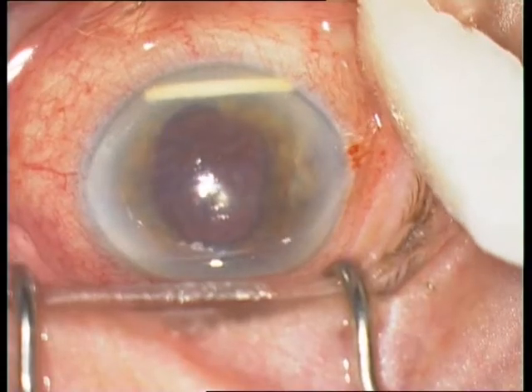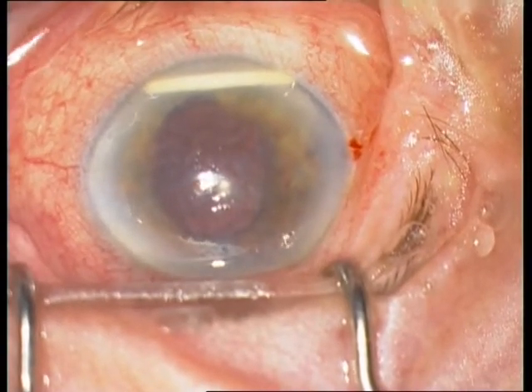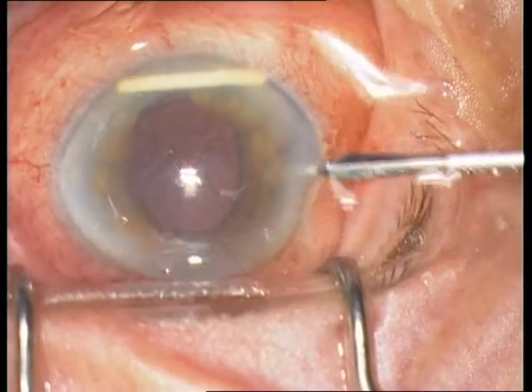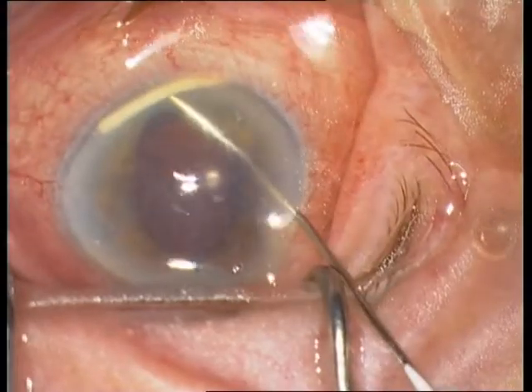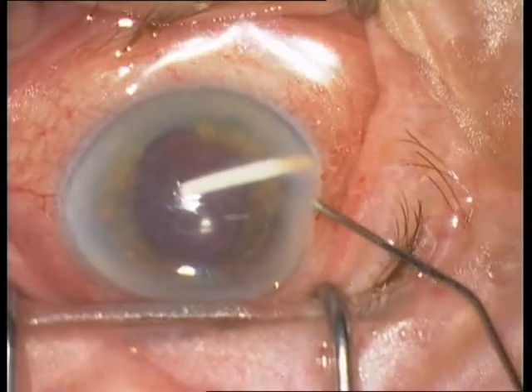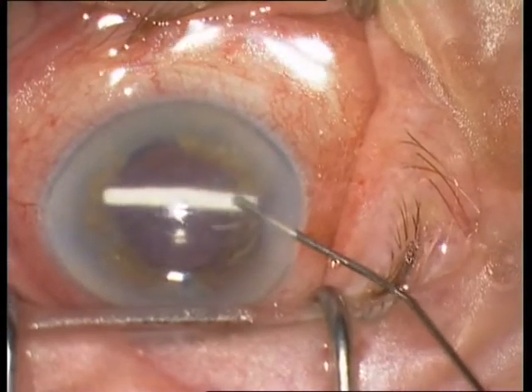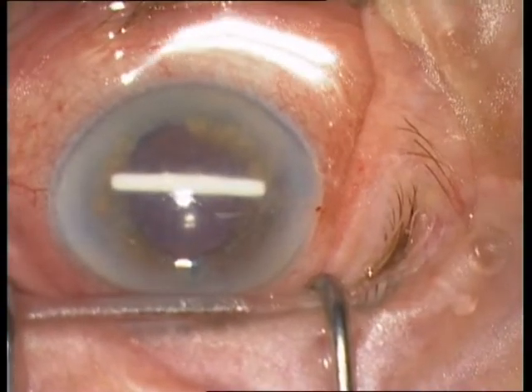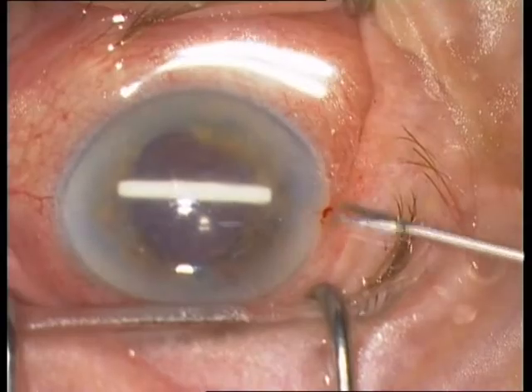The diagnosis is the migration of the Ozurdex implant into the anterior chamber. Remember that an iris claw lens is implanted and that the lens capsule is not present. There is no lens capsule in this eye. The next step is the removal of the implant.